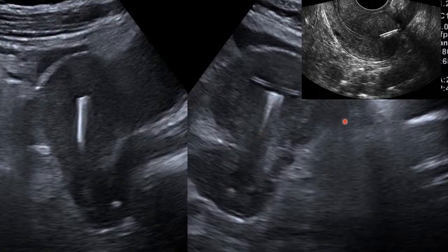So you can see that it's symmetrical. It's centered in the endometrium, as you can appreciate there. So the entire device is located within the endometrial cavity, as you can appreciate there. So I can't see any sonographic evidence of embedment.